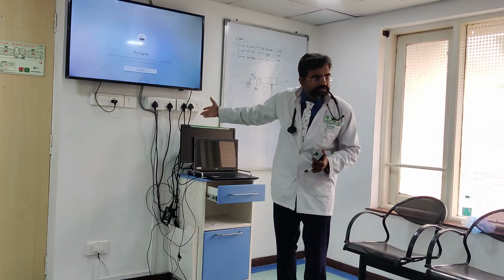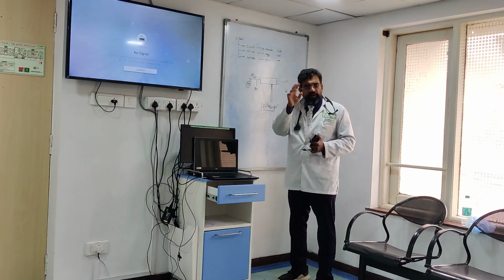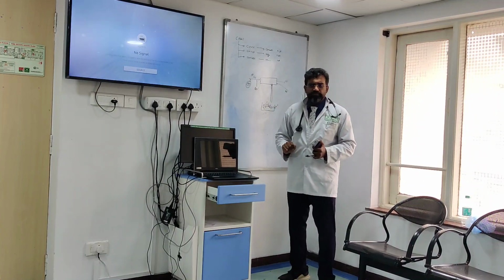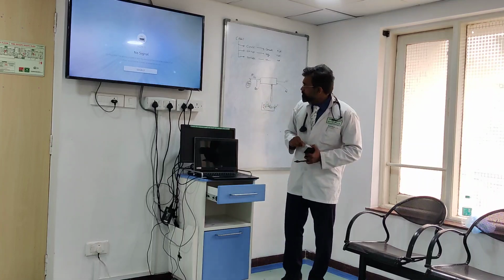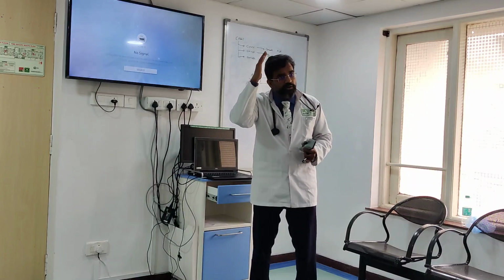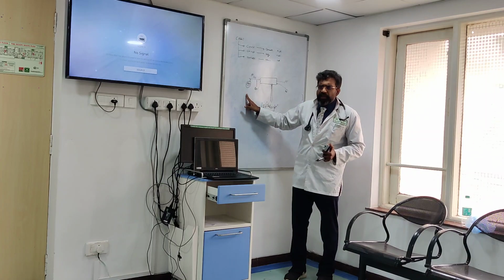I can figure out whether my machine is working well by looking at this. I'll send effluent urea and I will send blood urea. Both of them have to be divided, and it should be 1. If it is 1, it means this is optimally working. Right? Are you understanding? Because urea is easily monitored. Clear on this? I want it to be optimally working because my CRRT is going to start working at 12 to 24 hours.